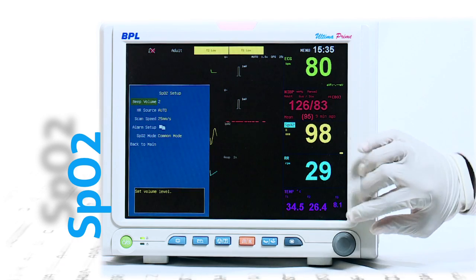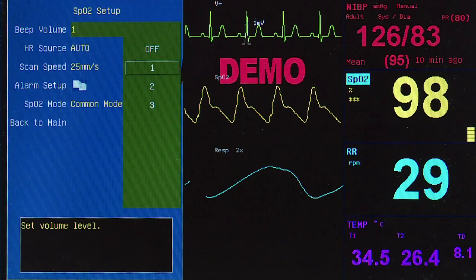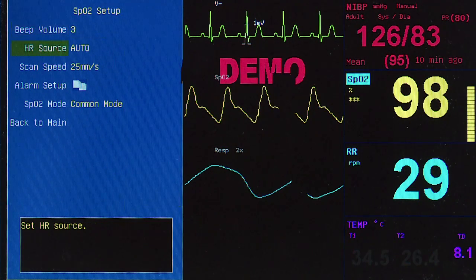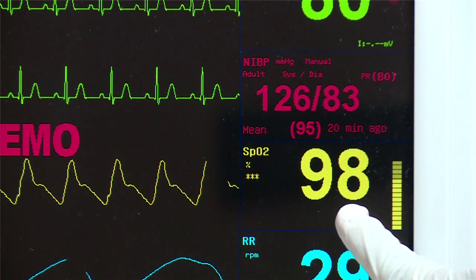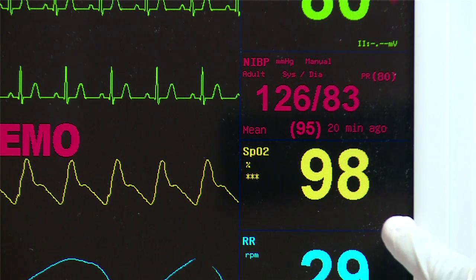With a number of options available for monitoring SPO2, Ultima Prime provides superior performance in low perfusion conditions, shivering conditions, and can be used for a wide range of patient categories.